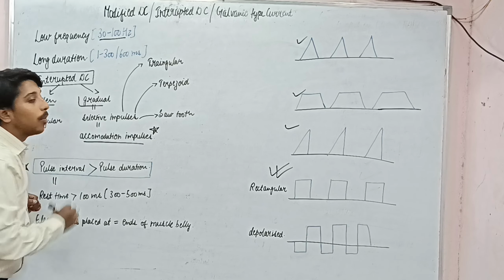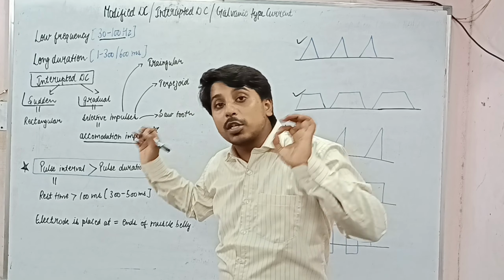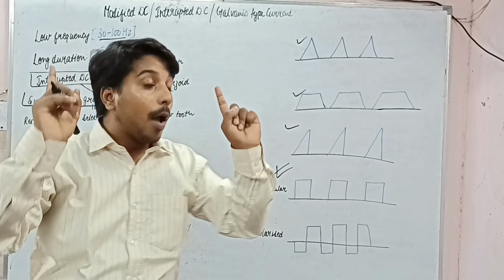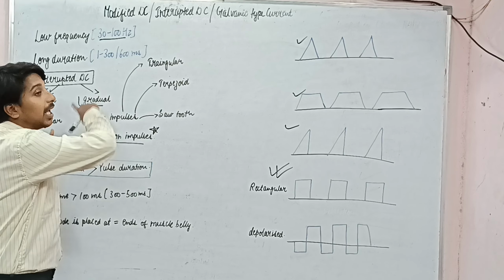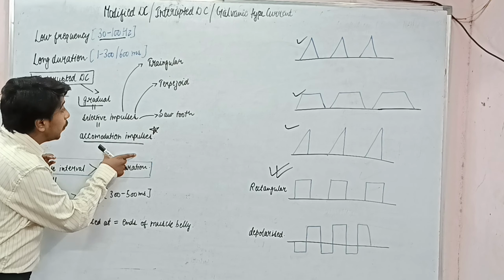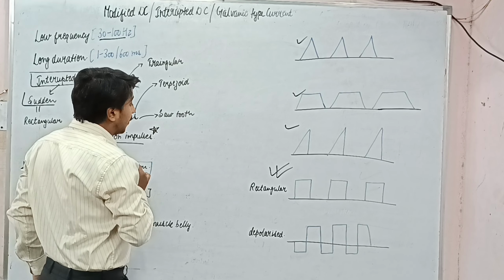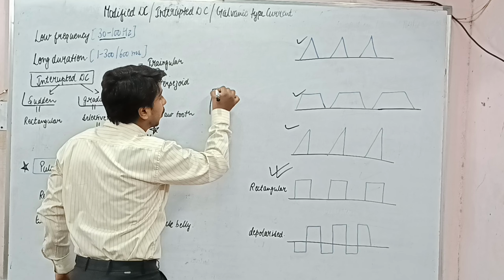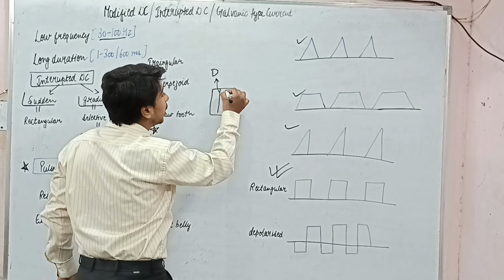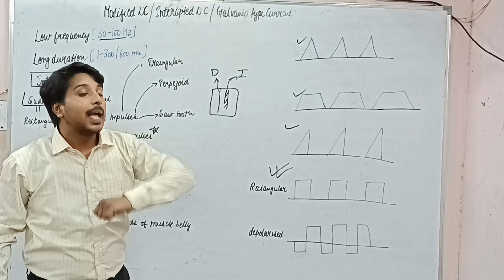Now why are they called accommodation impulses? In galvanic, though we can use rectangular impulses to stimulate the denervated muscles and it is of no problem, for a better effect we use these gradual impulses. Why? Because of two very beautiful explanations. First, these impulses increase slowly. For example, this is a body part. This is the muscle which is denervated, and around it is a muscle which is innervated. This line is the denervated muscle and this is innervated.